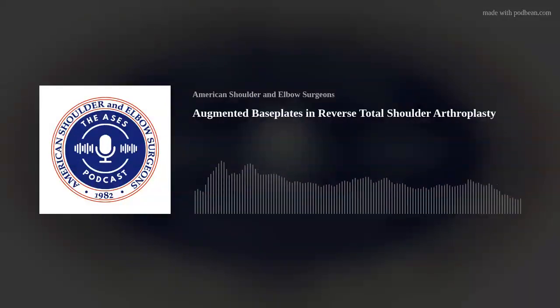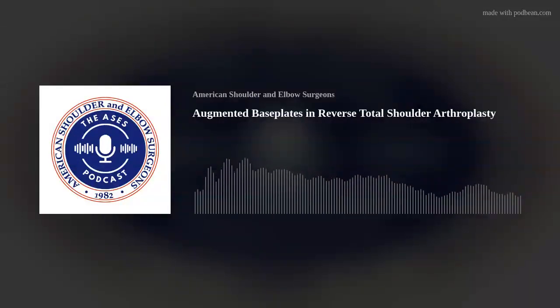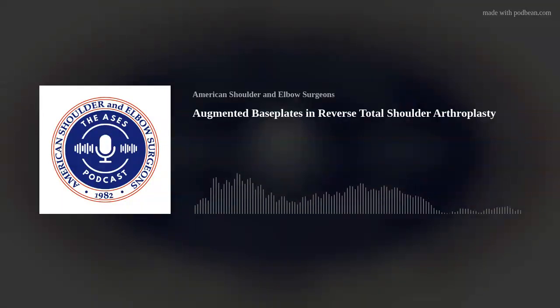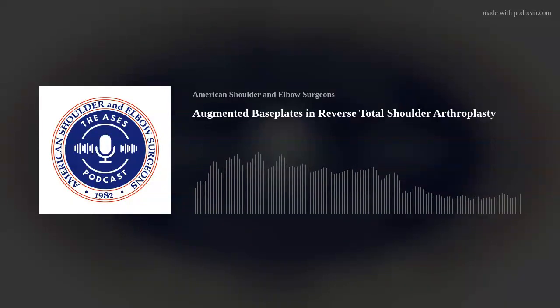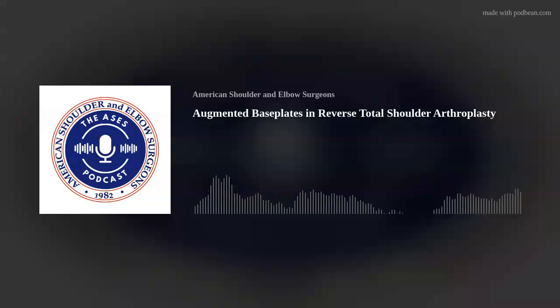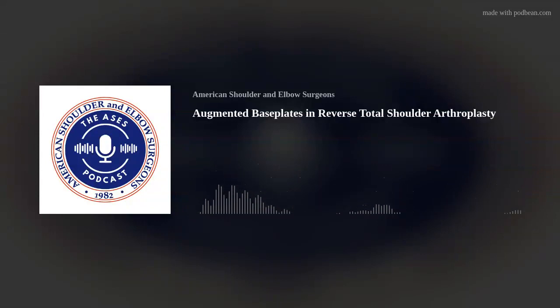Yeah, I agree with you, Andy. The one caution I would have is that I think what you said about inclination is also true of version, that our measurements of version on postoperative radiographs are maybe not as accurate as we would like. I think you could make reliable measurements, but they probably are not the same measurements as if you were to get a post-op CT scan, and there's relatively few studies that have post-op CT scans to actually measure what the version of the component is.